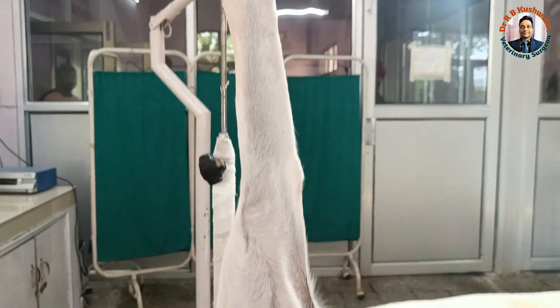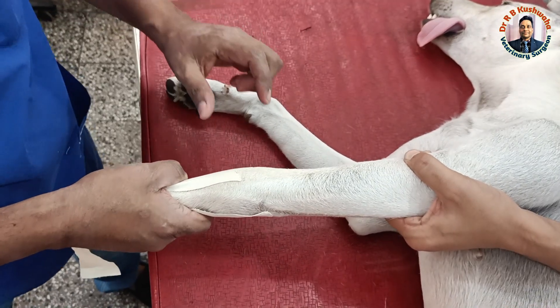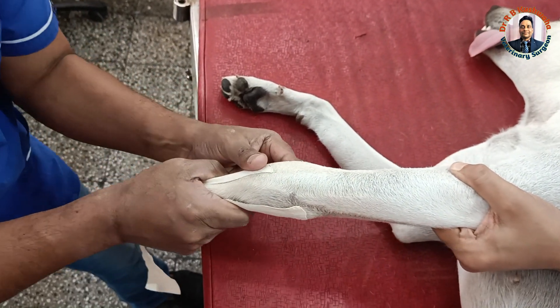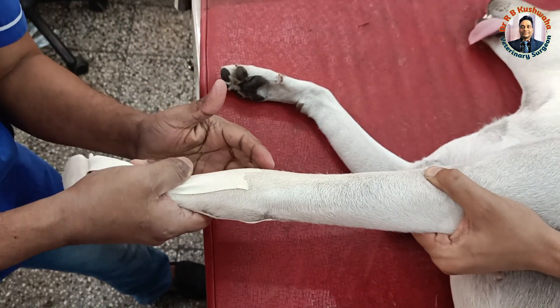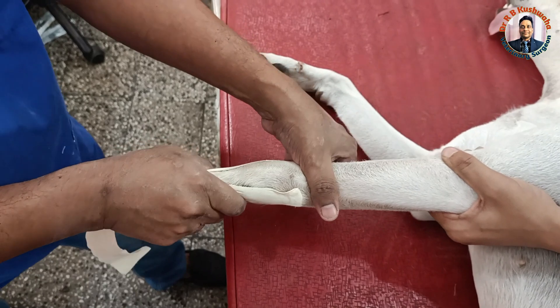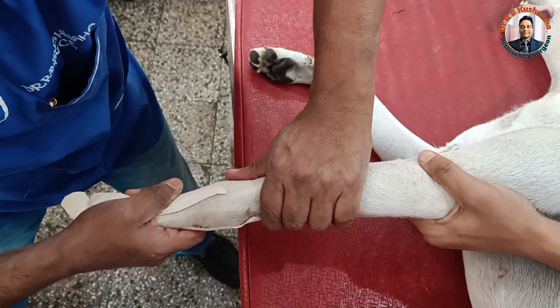Although we have already applied traction for 15 minutes by pulling this limb over the hook of the drip-set stand, we will now pull further. It is very difficult to reduce 100 percent in case of the Colles fracture by this method alone. At this moment I think it is almost reduced — there is some swelling at the medial aspect, but even if it is partially reduced, healing would occur.